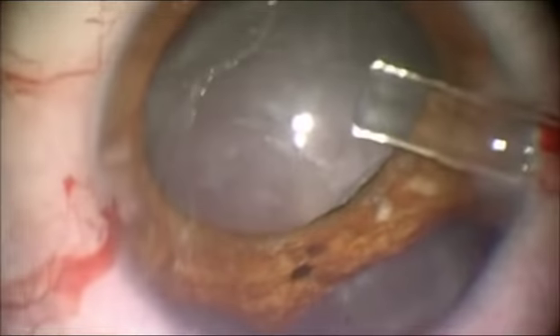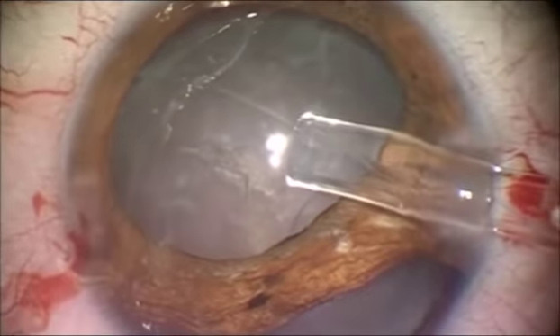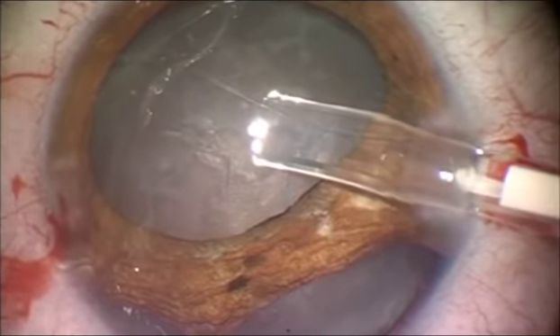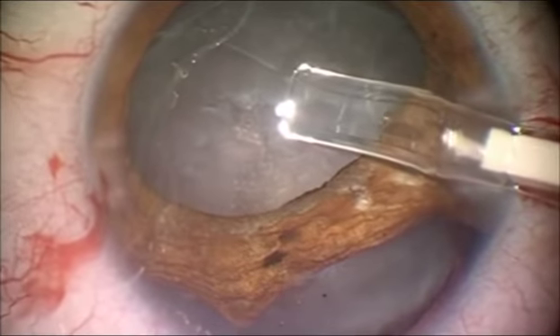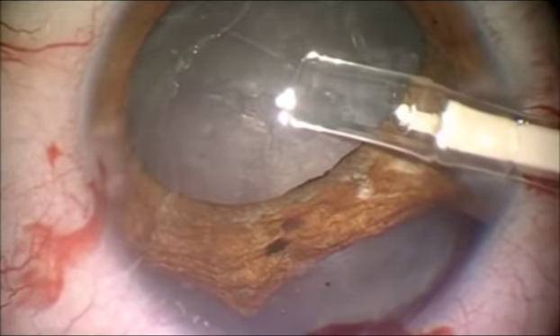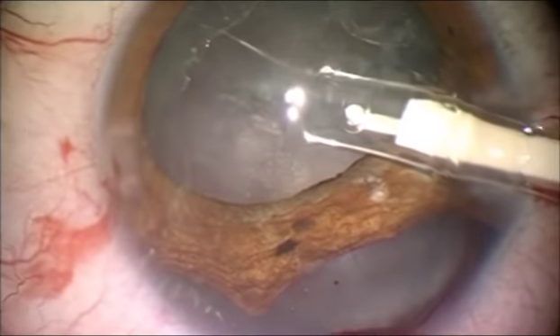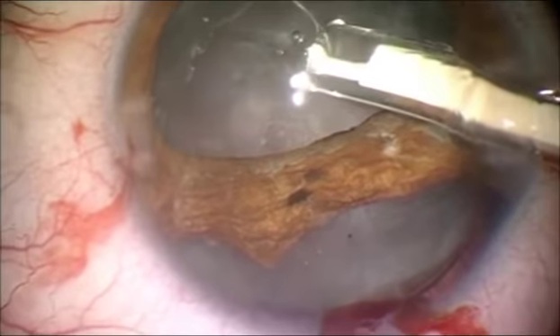In case the surgeon decide to implant CTR at the very beginning of the procedure, before nucleus content is removed from the capsular bag, he should be aware of cortical material entrapped to the equator of the bag by the CTR, which requires much longer irrigation aspiration time as opposed to the CTR implanted into the empty capsular bag.